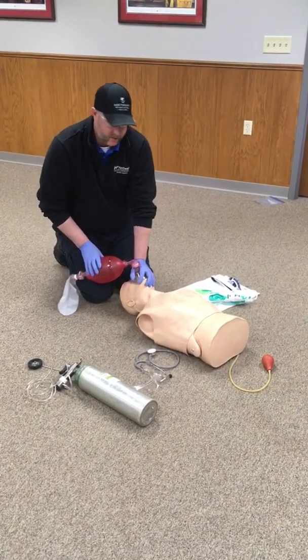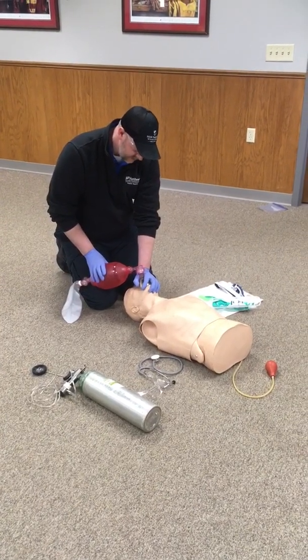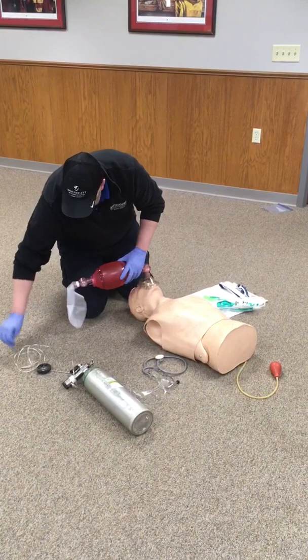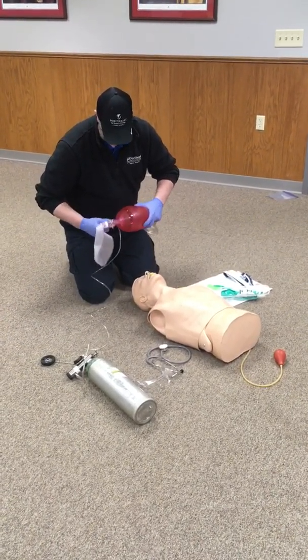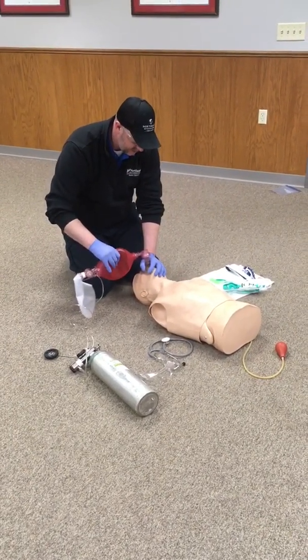However, the patient's SpO2 is low — so maybe it's 82%. So we're going to go ahead and attach oxygen at 15 liters per minute. Make sure the oxygen is on, and we're going to continue our ventilations.